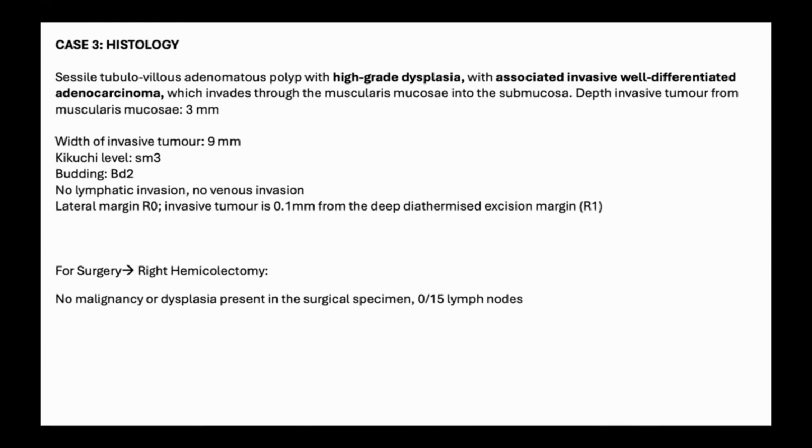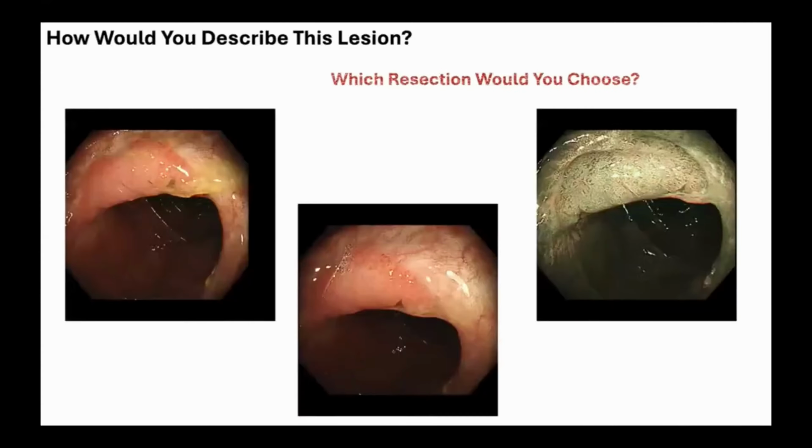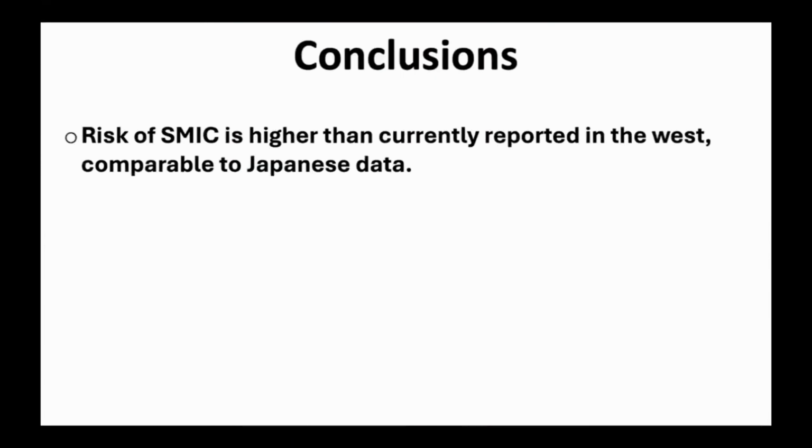Anyway, the patient was sent for surgery, and guess what? There was no dysplasia present in the surgical specimen. So this was curative. ESD was curative. Now, for the sake of time, I'll jump to the conclusion.